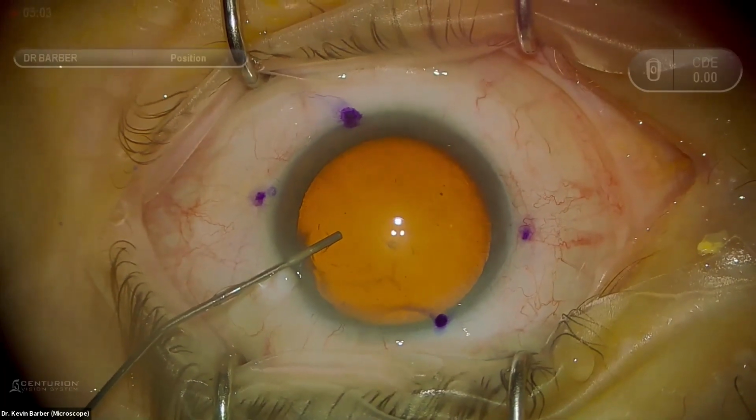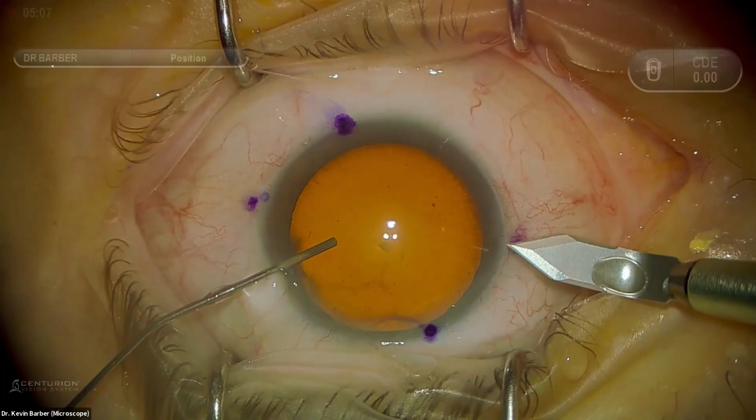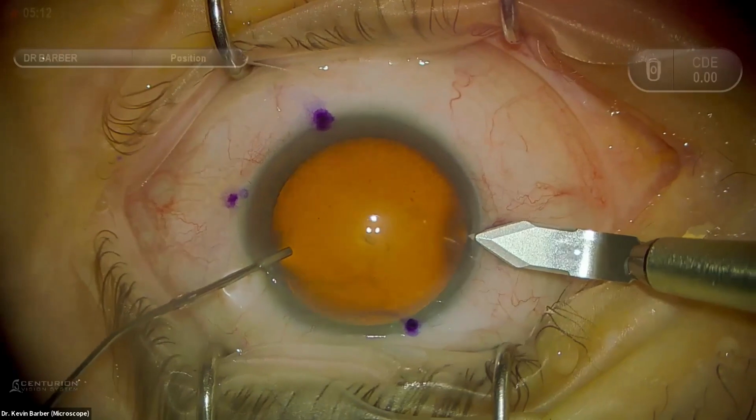All right, so pretty standard stuff here. You can see this is a very deep anterior chamber, much deeper than before. So our first patient was a +3. This is a -5.